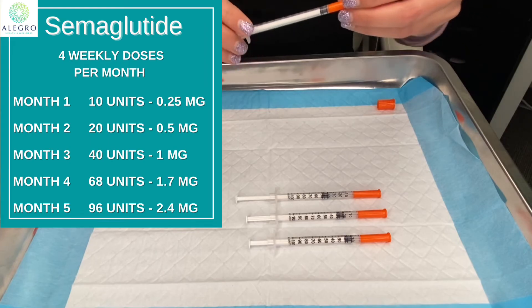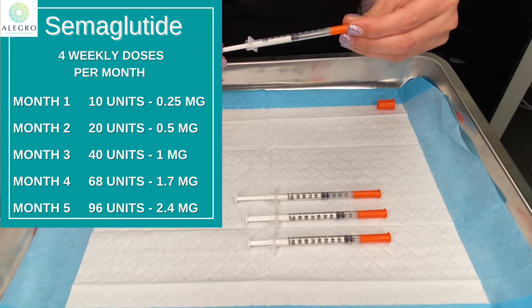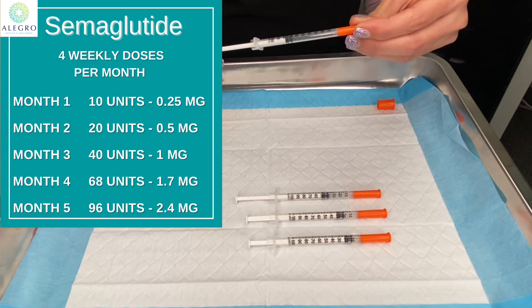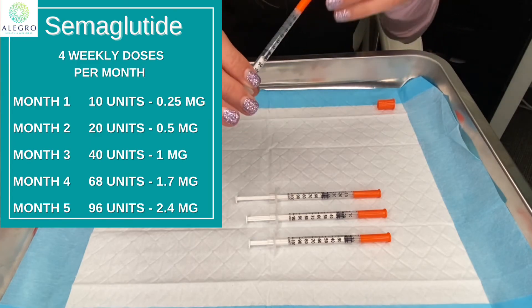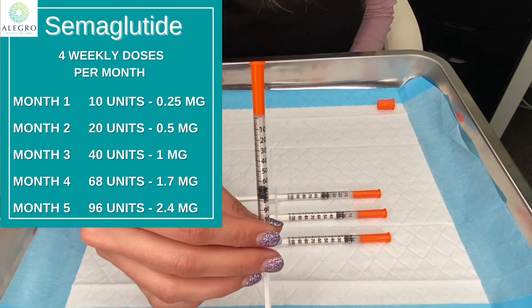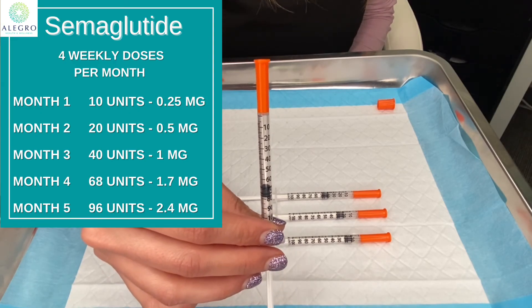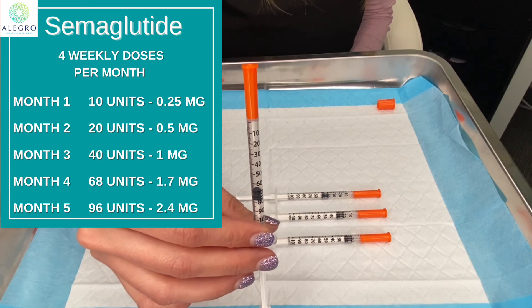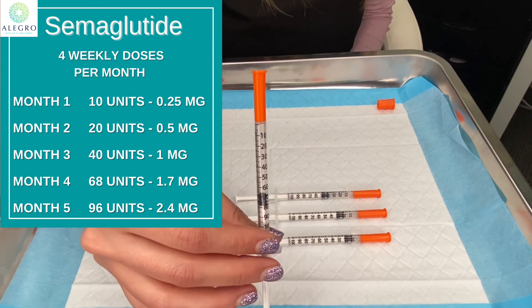To show you on the syringe what the next dose would be for month four: month four is 1.7 milligrams, which is the 68 unit line on the insulin syringe. So it goes from one milligram in month three to 1.7 milligrams for month four, which is 68 units.